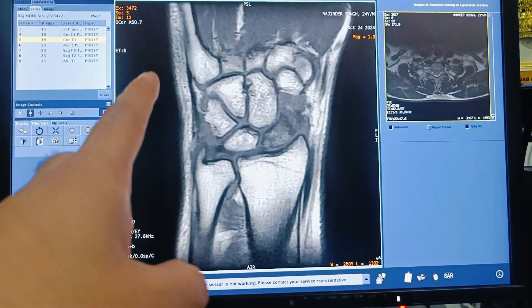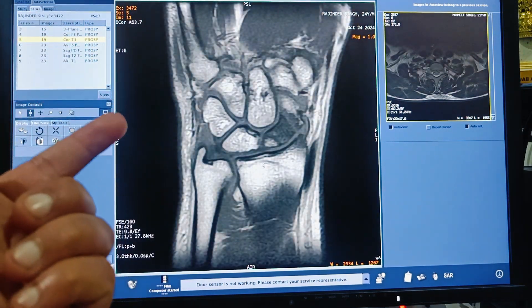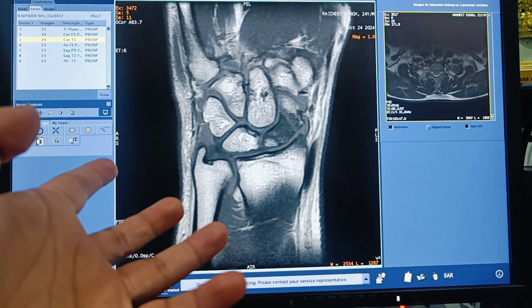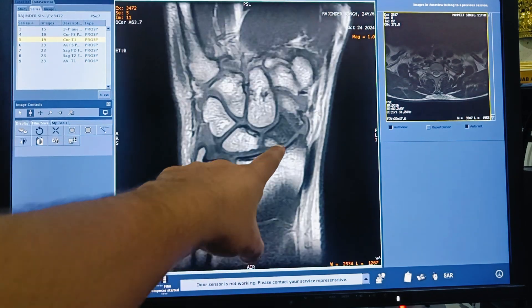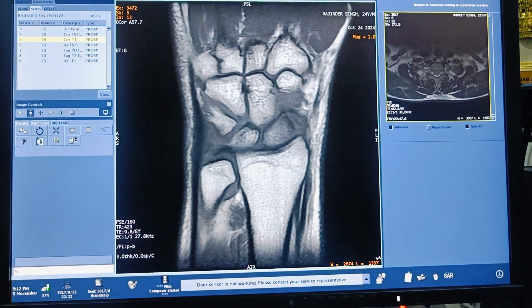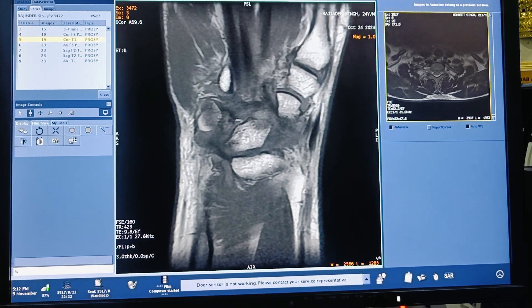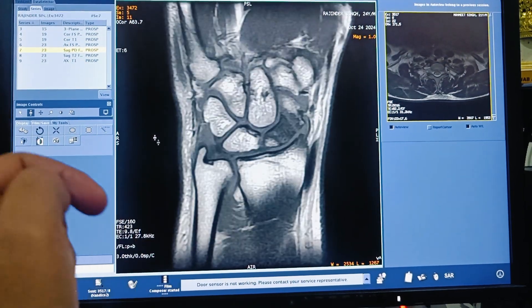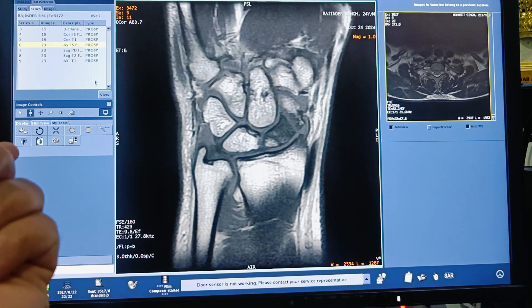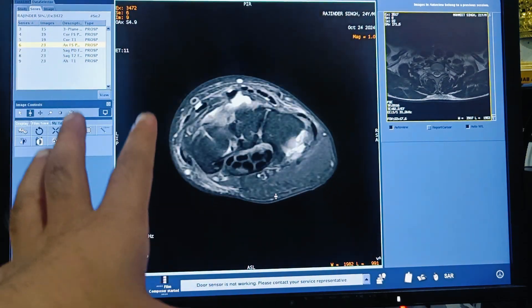The next sequence to acquire is the coronal T1 weighted sequence. In T1 weighted sequences, pathological findings such as scaphoid fractures appear hypointense. This is a coronal T1 weighted sequence where you can observe the hypointense appearance of the scaphoid fracture.